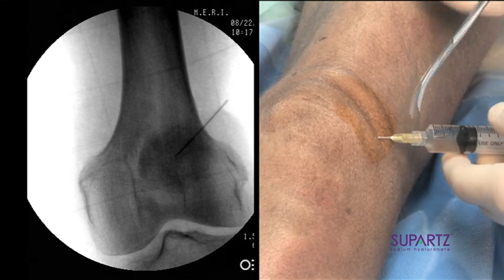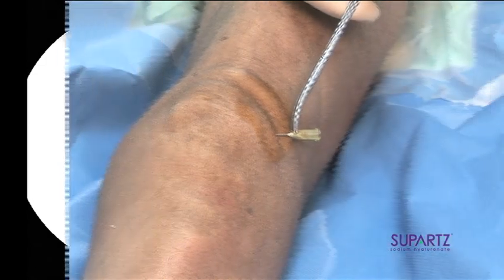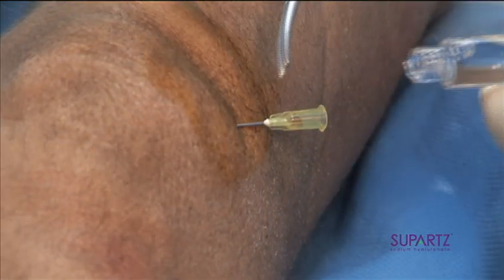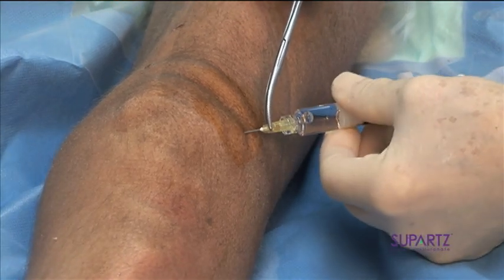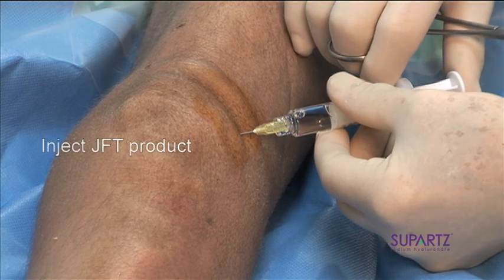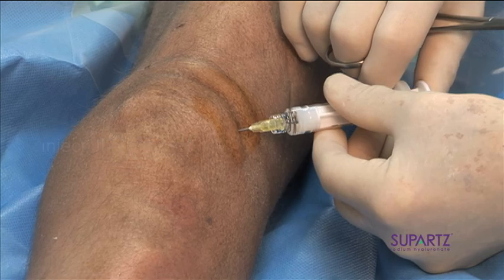Then we'll use our hemostat to steady the needle, which will disengage. By the aspiration, we know that we're in the joint. We attach our SUPART syringe and inject, and we're done.